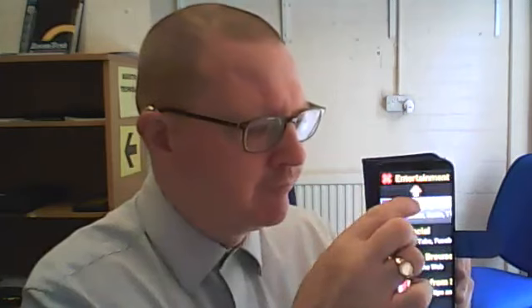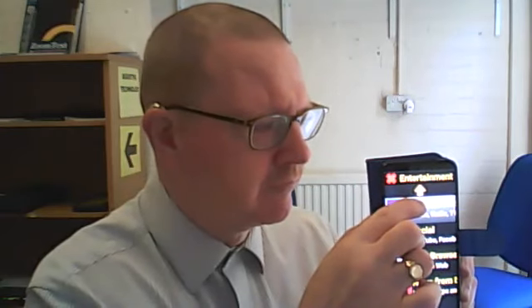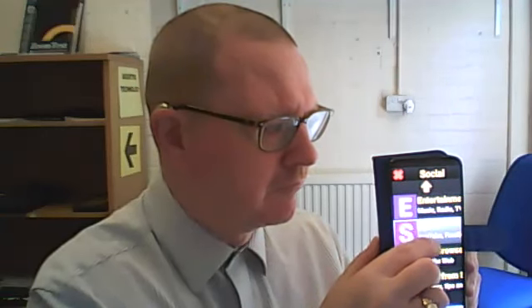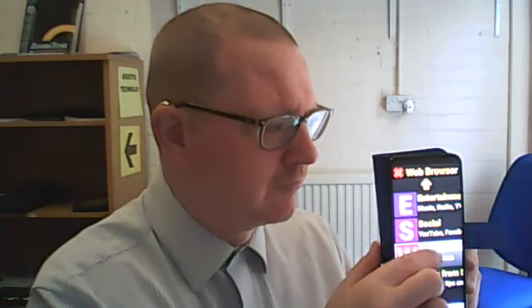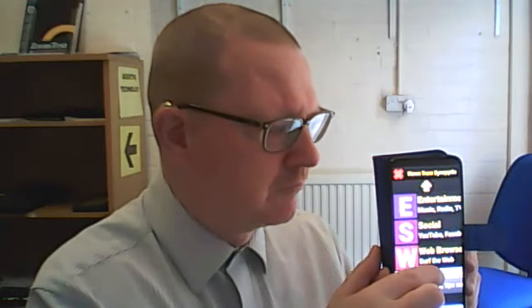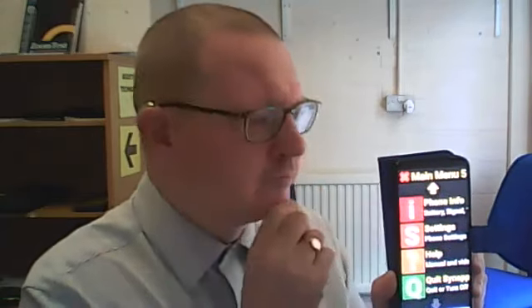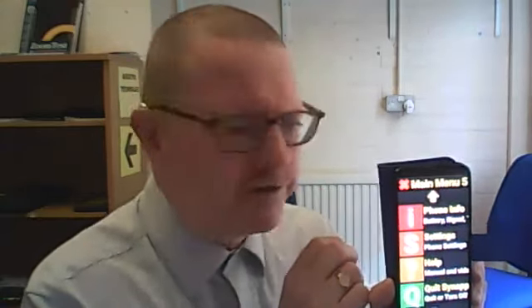Go down this one. Entertainment, music, radio, TV and news. Social, YouTube, Facebook. Web browser. News from Synapptic. Updates, next page of main menu. Main menu, page 5 of 5. And this is page 5. This is the final page.